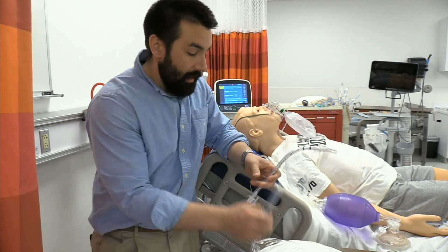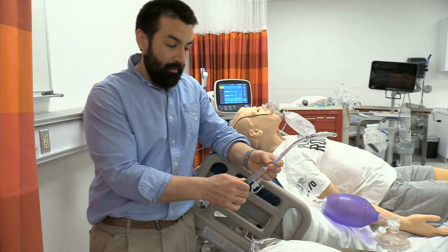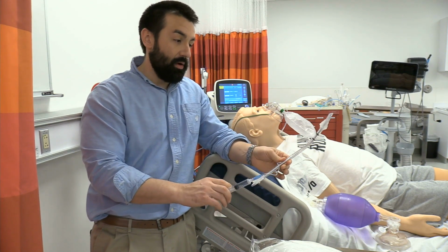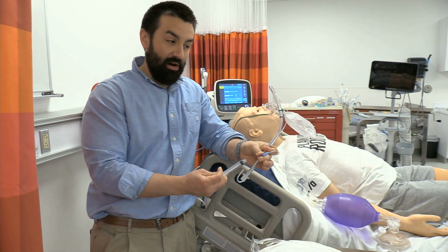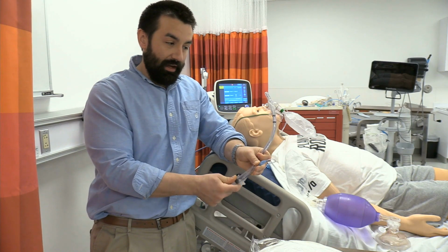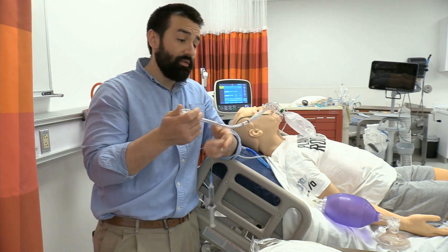I've already done this, but I'm going to show you again. I have a 12 mil syringe. I'm going to pull that back, have a nice volume of air inside of there, firmly seated in the pilot balloon. I'm going to inflate that cuff. I briefly take it off of the pilot balloon just to make sure that valve's not bad before deflating that, so it's ready to go. If you forget to deflate and you hand it to the doctor, they're never going to forgive you for that.